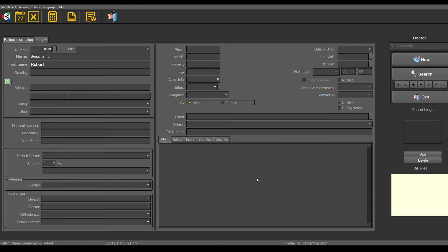Hi, Robert Beauchamp for the training on the software today. Today we're just going to talk about how to enter a picture into the CADDI data screen.